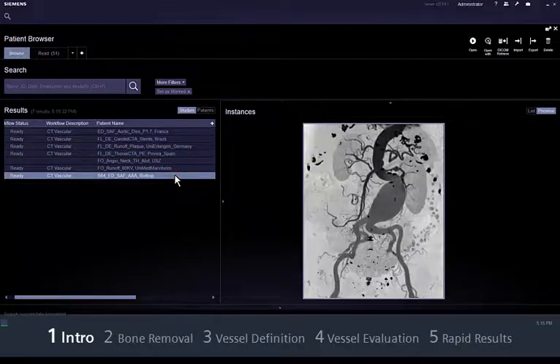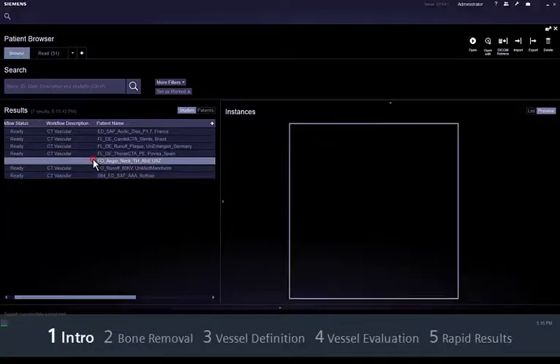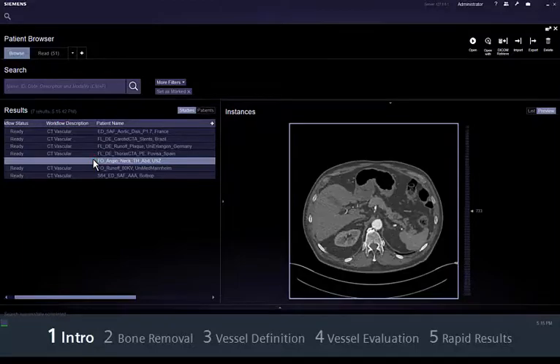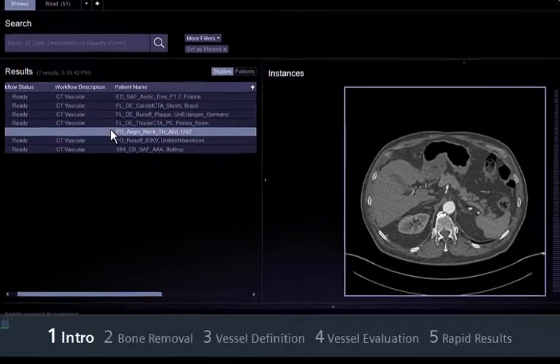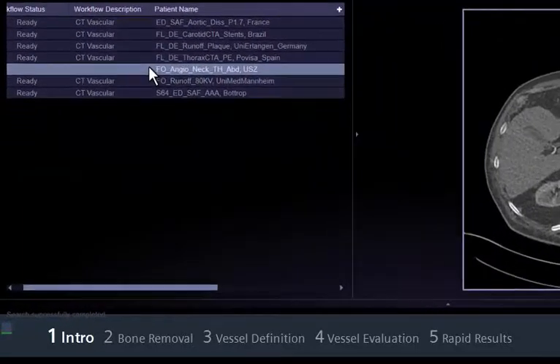With Syngovia, you benefit from clinical applications that support both speed and routine, which are essential in challenging cases. This movie will show you how to evaluate CT vascular datasets using Syngovia.